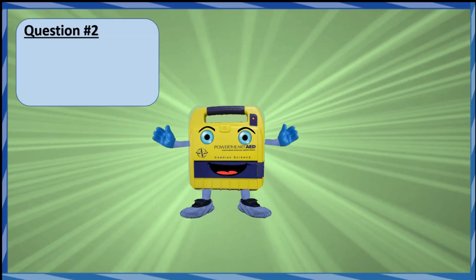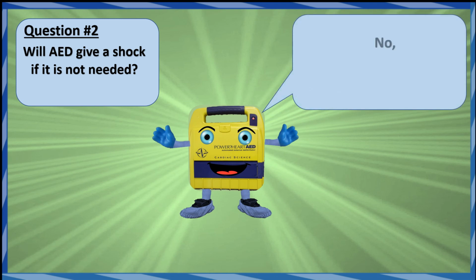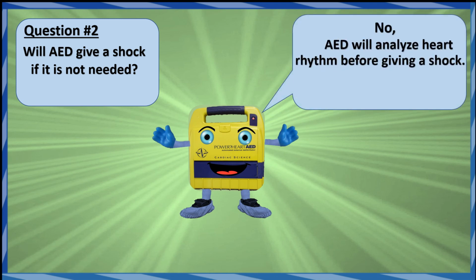Question number 2. Will AED give a shock if it's not needed? No. AED will analyze heart rhythm before giving a shock. If shock is not needed, it will not give one.